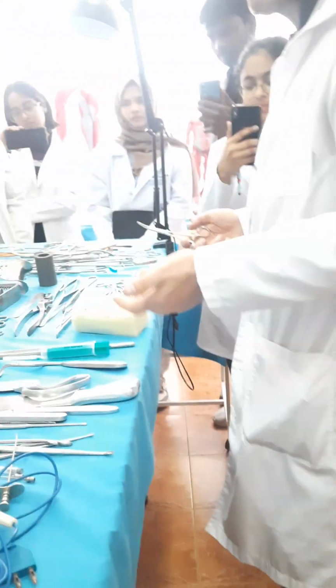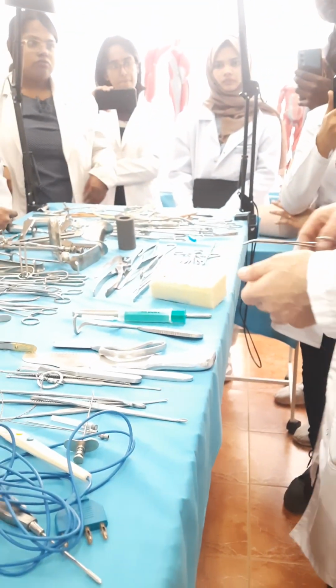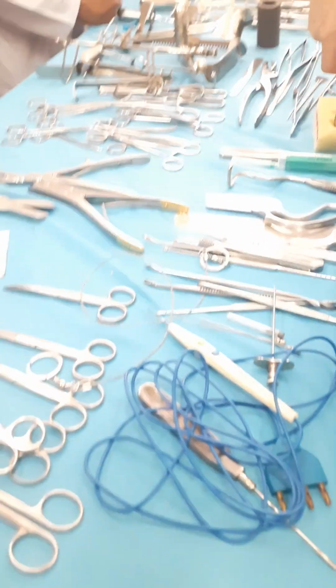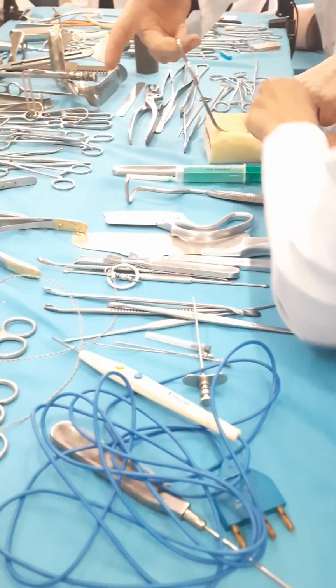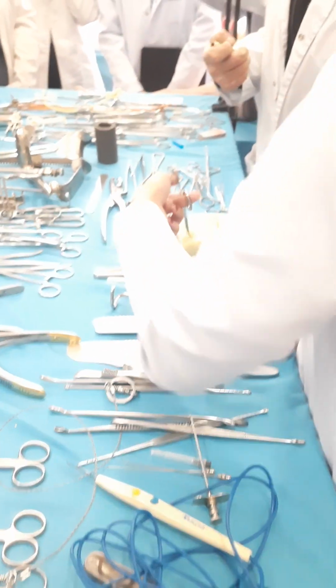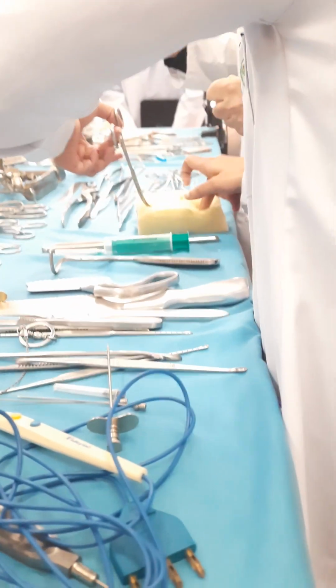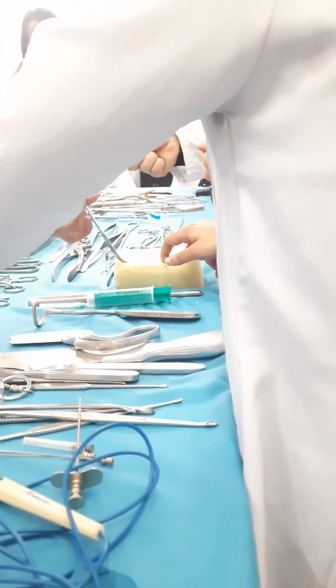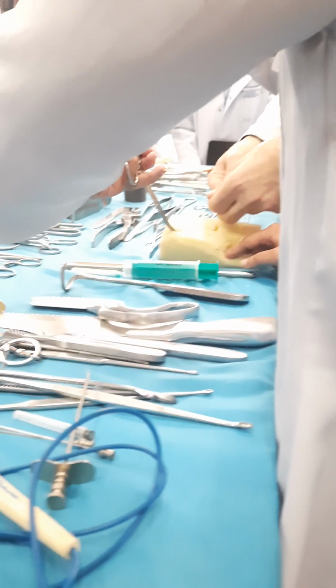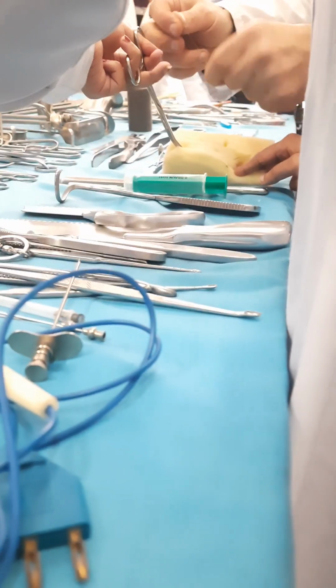Or finally, I can make the permanent methods. Come to me. Hold this sponge. Now I apply the arterial forceps here. Hold it, please. Don't sleep. What after this? After this, I must permanently arrest the bleeding. Not only suture, mainly not the suture. The first manipulation we call ligation. Let's say now I ligated this artery.